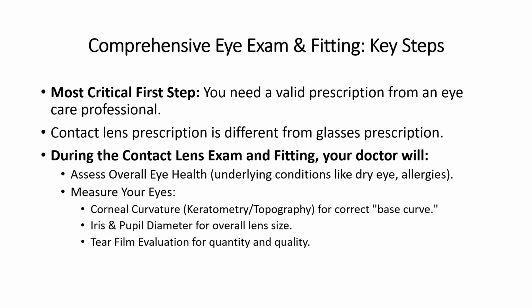The most critical first step in contact lens wear is a comprehensive eye exam and fitting. You cannot, and should not, buy contact lenses without a valid prescription from an eye care professional. It's important to understand that a contact lens prescription is different from a glasses prescription. It includes specific measurements and parameters related to the contact lens itself, not just your refractive error.